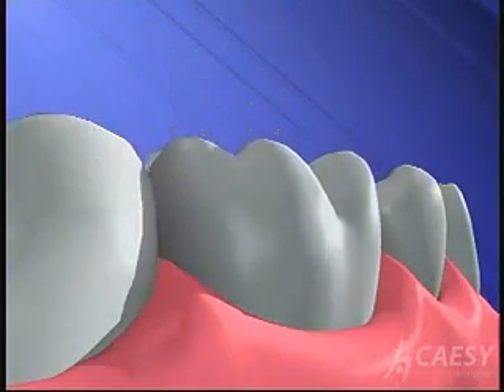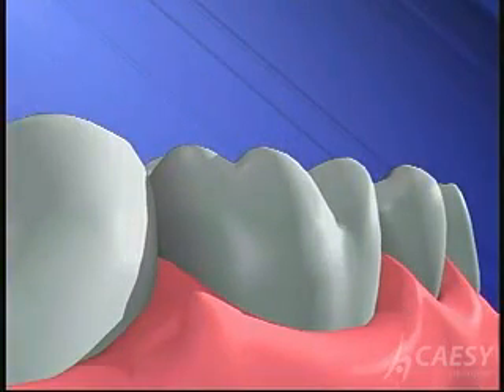Making a crown is the last step in restoring your tooth. It protects your tooth and gives you back your smile.